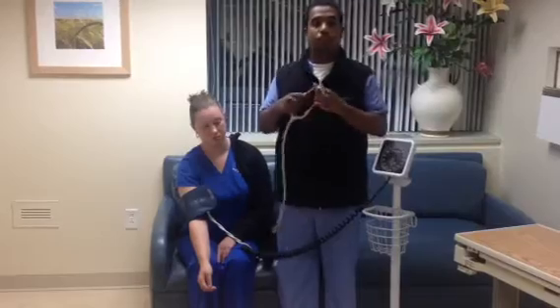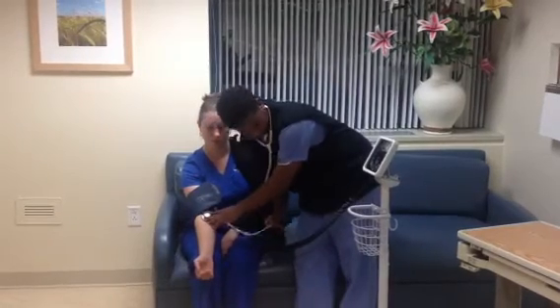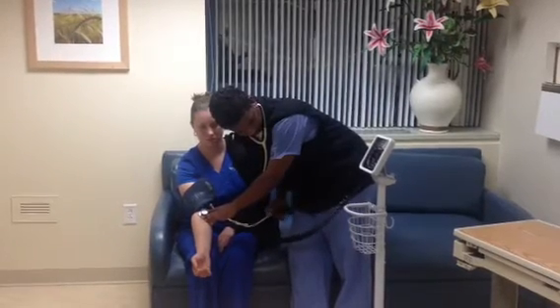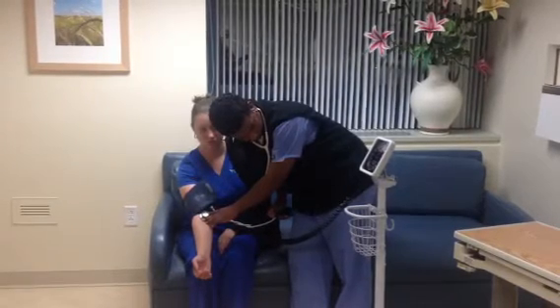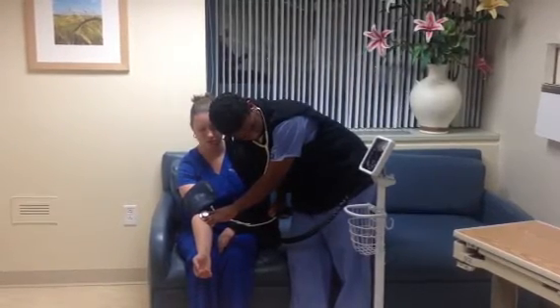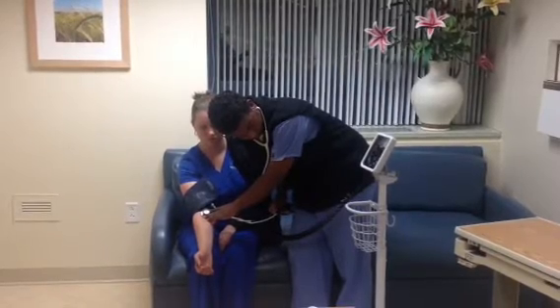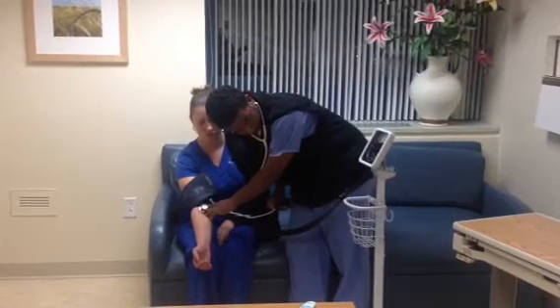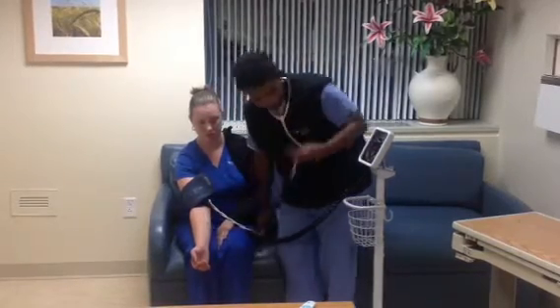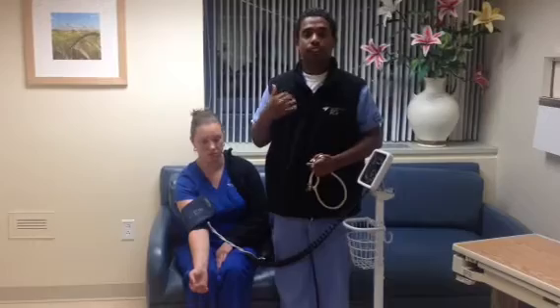At this moment, I will be performing a blood pressure. The first thud I heard was at 118. At around 80 the thuds are getting lighter, and the last thud I hear is at 66. So her blood pressure was 118 over 66 — her systolic is 118 and her diastolic is 66.